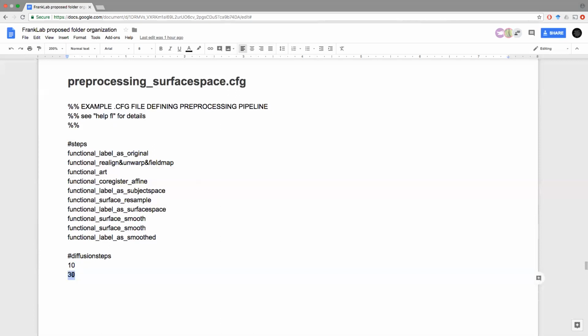And so you apply that 30 times. It means that effectively, if you were to compute the effective range, all the way up to 30 neighbors could potentially affect your data, but the actual level of how much they affect is an exponential decay. So the 30-step neighbor is only affecting minimally compared to the actual closest neighbor to your data, because they have an exponential decay type of rate of influence. So I don't know, that's one way to see.